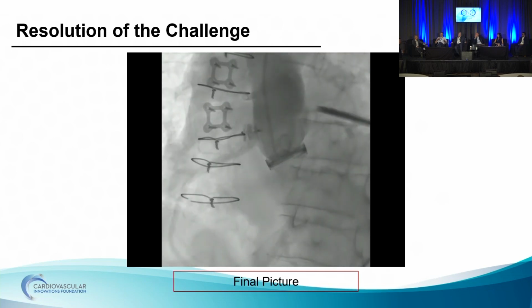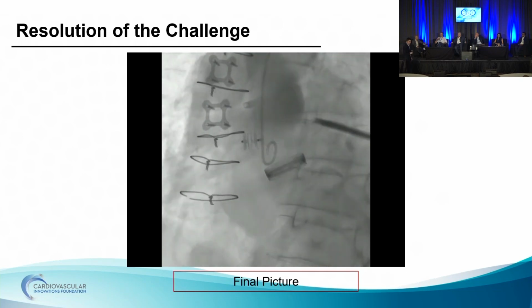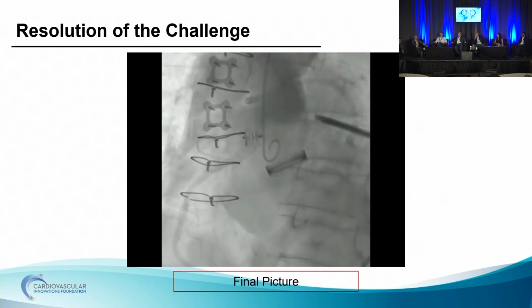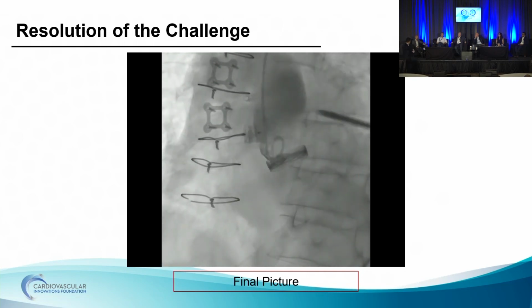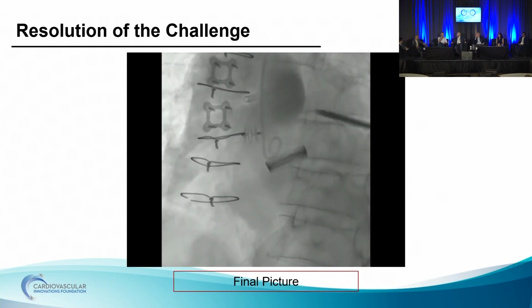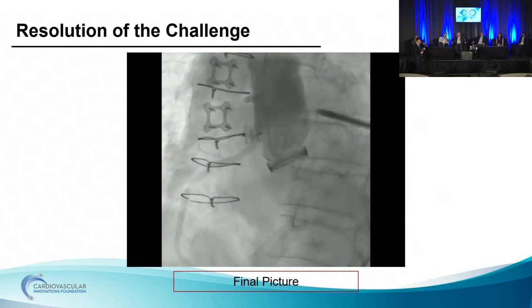My only thought is how much of that plug is sticking out into the aorta? It looked like quite a bit, and so re-engaging that in the future will be a challenge. For the sake of time, I didn't put all the re-engagement pictures in. It does make it a little bit different for sure. That's why we tried to use a bigger one, to give more room and flare out the tip a little bit, so you can allow for further re-engagement. But it's definitely not your ideal scenario.